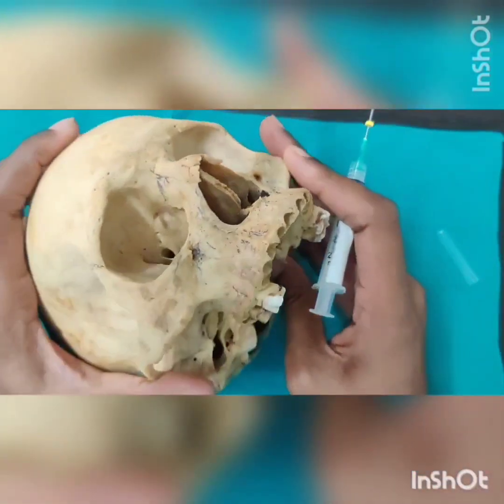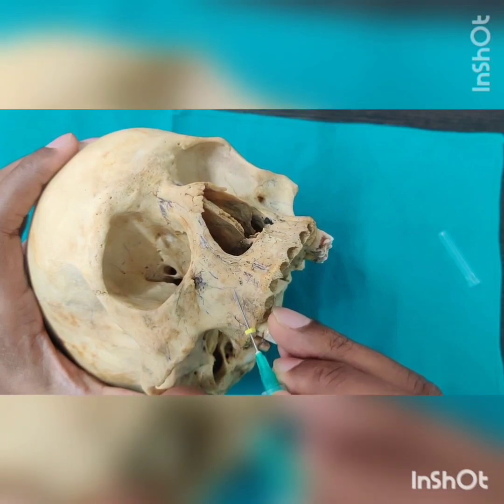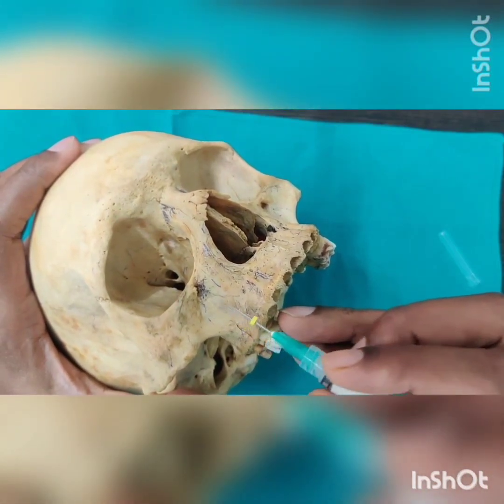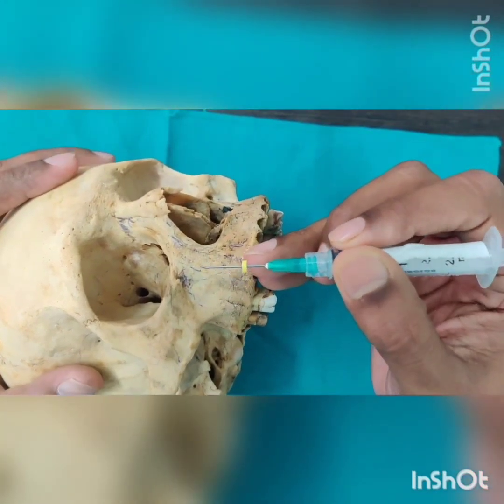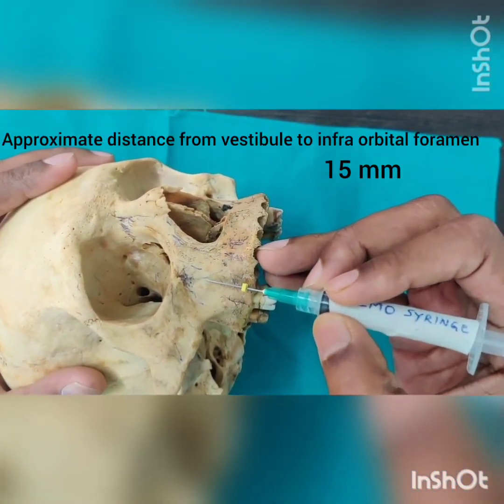From the vestibule around the premolar roots, the needle is directed parallel to the long axis of the teeth, with the bevel of the needle facing towards the bone.